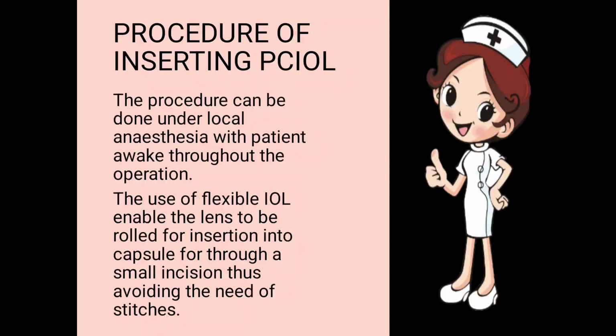Okay, the procedure is done under local anesthesia and the patient stays awake throughout the operation. Only local anesthesia is given to the eye of the patient, not the whole patient. The flexible IOL enables the lens to be rolled and inserted into the capsule through a small incision, thus avoiding the need for stitches.